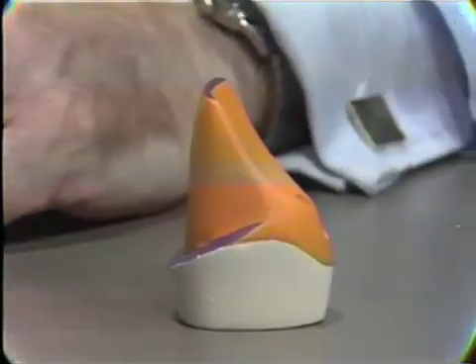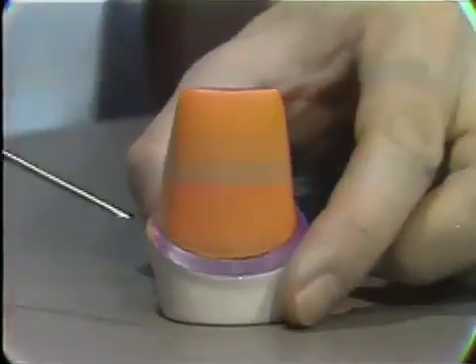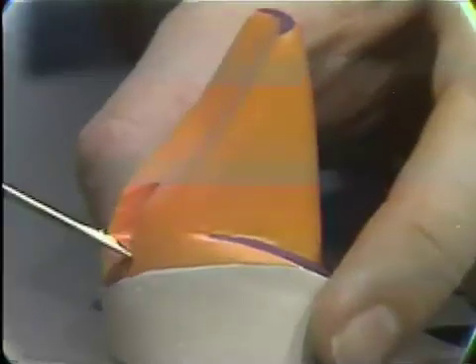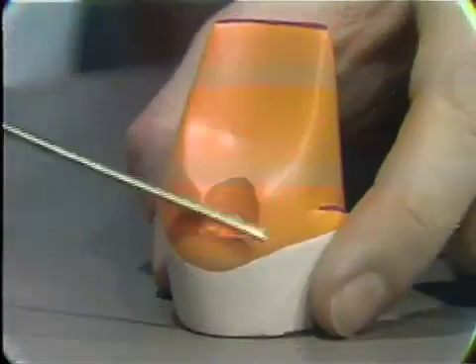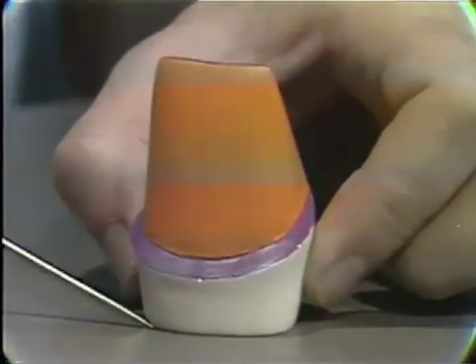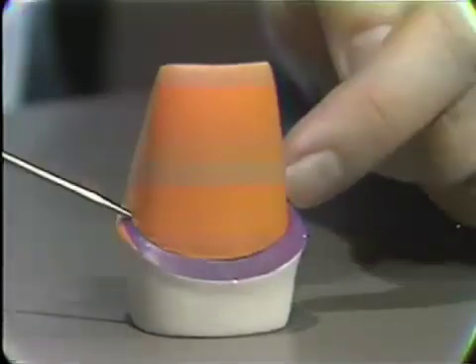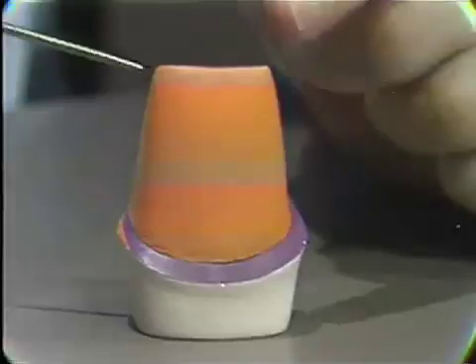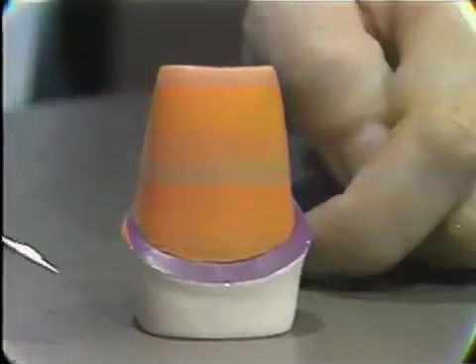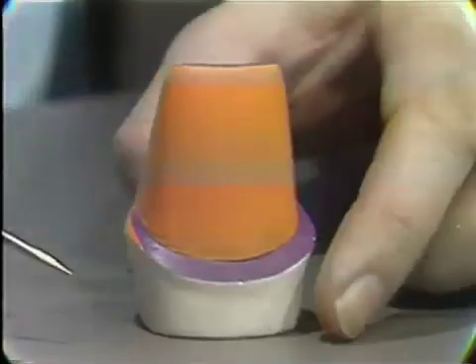The preparation on an anterior tooth is made with a labial shoulder, such as you see here, which fades away in the proximal surfaces to either a shoulderless or a chamfer finish running around the lingual surface here. As you know, in the finished preparation, the lingual surface is generally gold, and the labial surface either porcelain or resin, according to the type of facing which is utilized. It's important in these preparations, as in all other situations, to keep a minimum taper to the axial wall, just sufficient for convenience in taking impressions and so on, but the minimum taper gives the greatest retention.